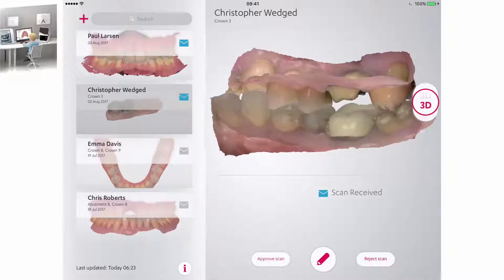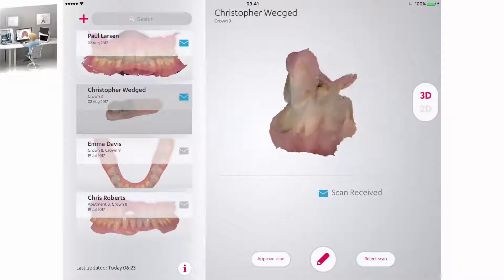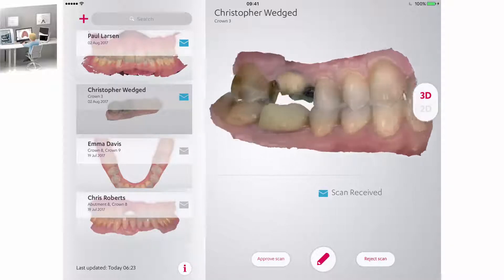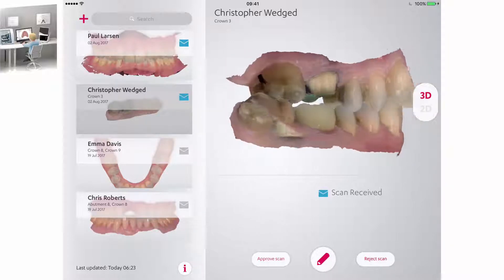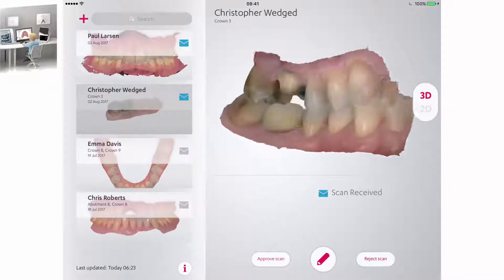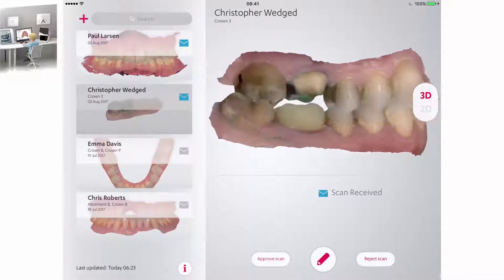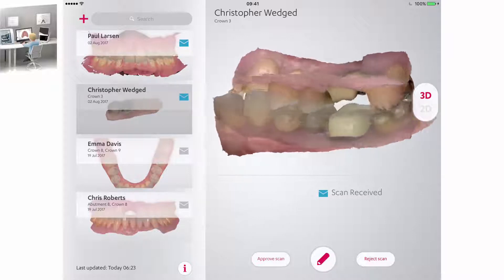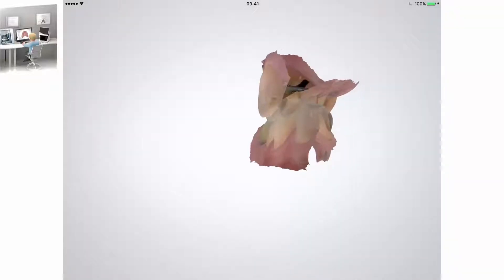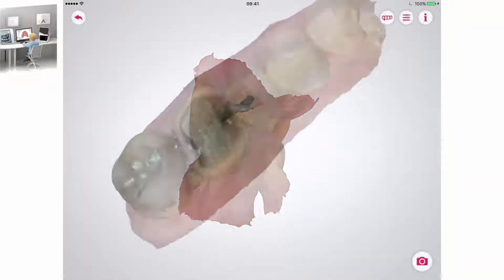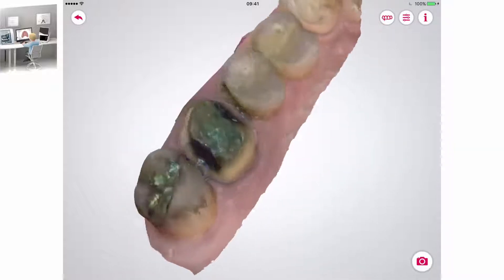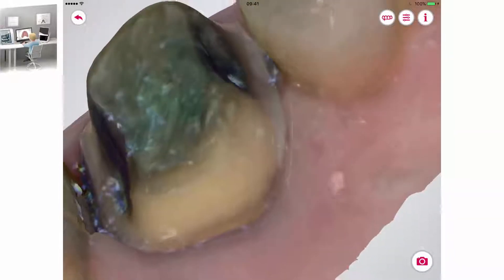In the window on the right you will see the rotating 3D view of the scan. Examine the scan and add any additional communication to the case if necessary. Communicate enables you to take a photo of a certain part of a 3D scan. First you must touch the scan in the 3D viewer and a new window will show up, where you can have a detailed look at the scan and take photos.